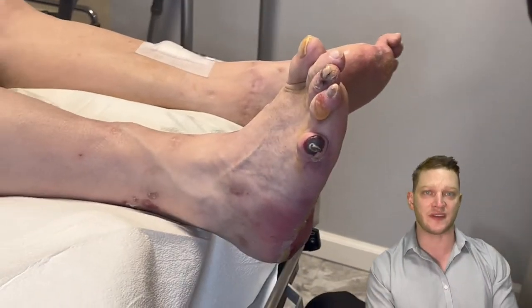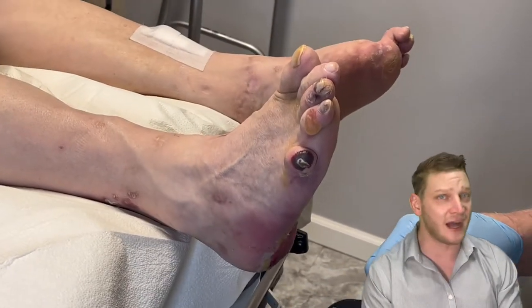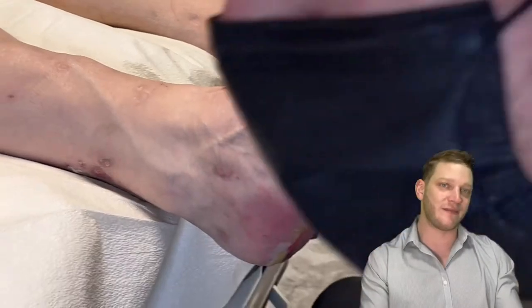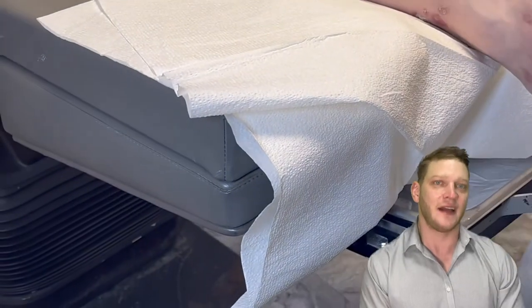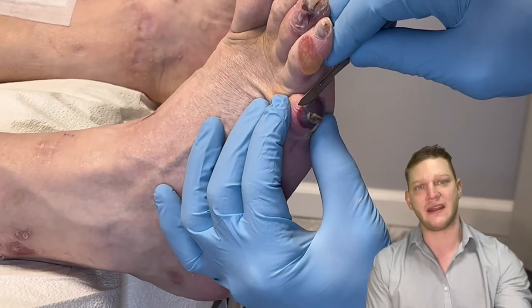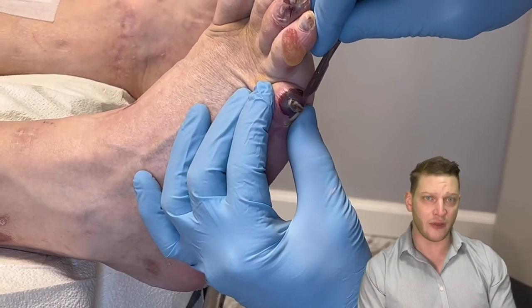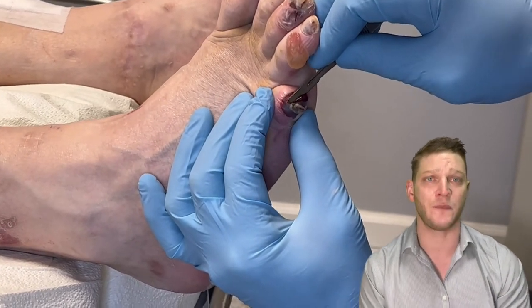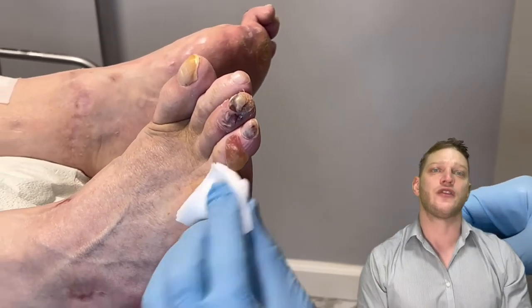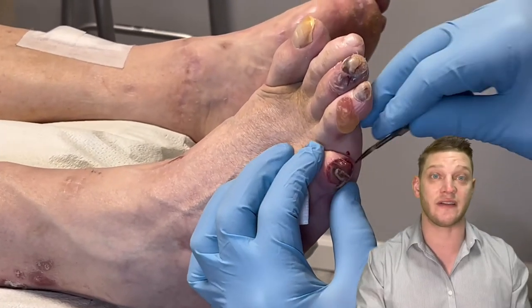Here on the fourth toe you'll be able to see there is a serous blister — that one that's fluid-filled and not red. What we're going to do is let that water out, but we're going to leave the roof intact; that's going to act as a natural band-aid. When I make the incision on the fourth toe, I make it on the plantar aspect so that gravity will help drain it as he walks around.